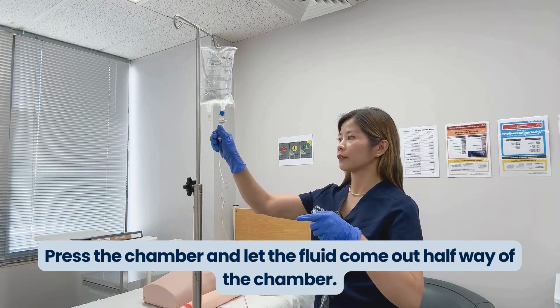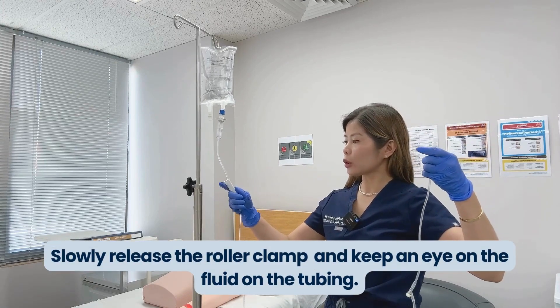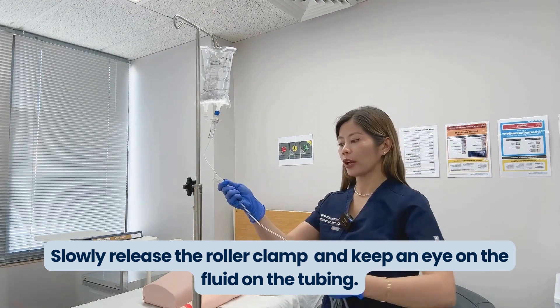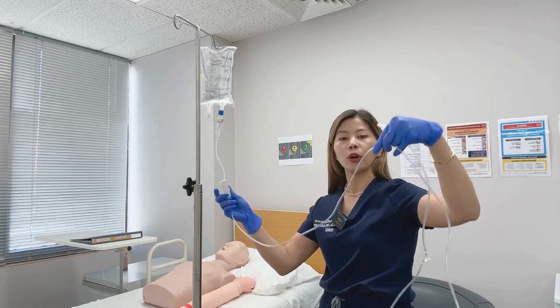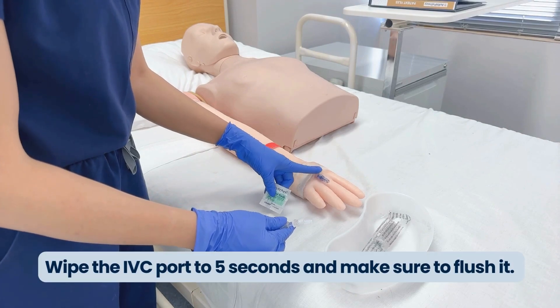Make sure your tubing is free from any tangles. Then slowly release the roller clamp and keep an eye on where the fluid is flowing, to make sure that there are no air bubbles flowing through your tubing.